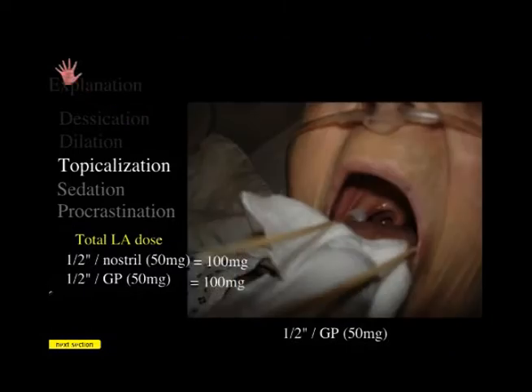I can pull the tongue to the side, and I can put my lidocaine, here's my stick and my lidocaine, right up against that palatoglossal arch. By the way, I failed to mention the reverse side of your card is the cheat sheet for the 6-finger technique, okay?